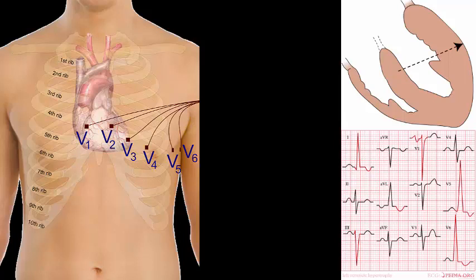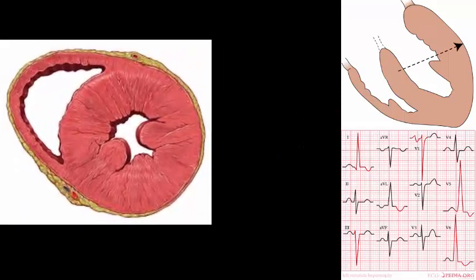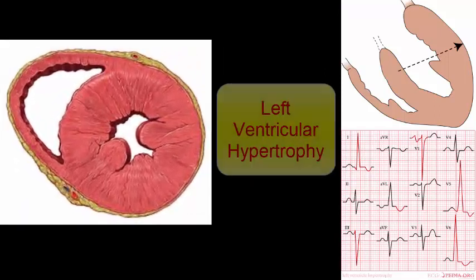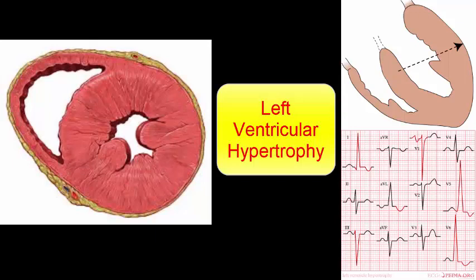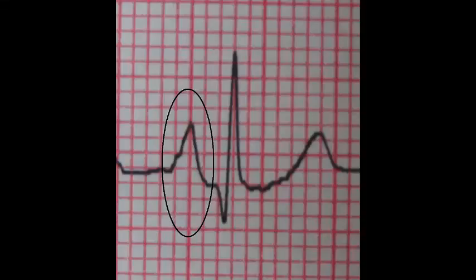Let's begin. The ECG is used to assess heart rhythm and conduction. It provides information about heart chamber size. We are interested mainly in the left ventricle, which is the main pump affecting blood pressure and circulation, but sizes of the right ventricle and both atria are also important and can be estimated by looking at the ECG.